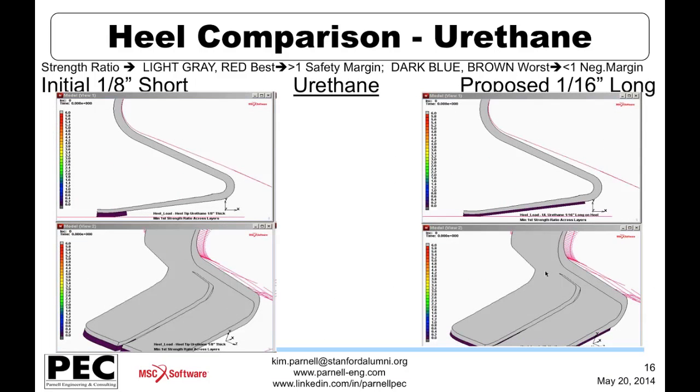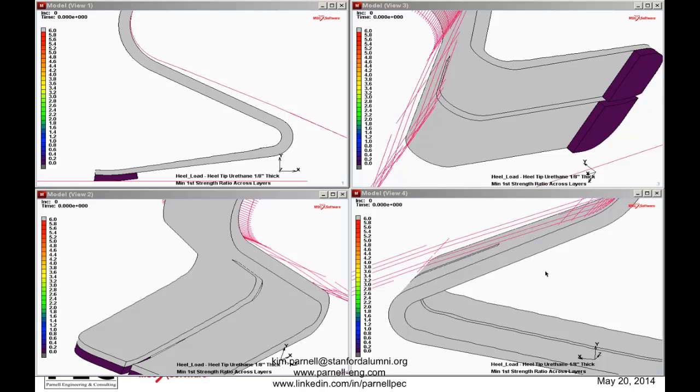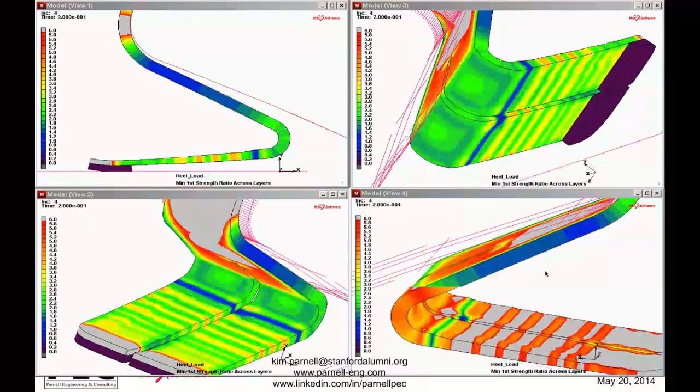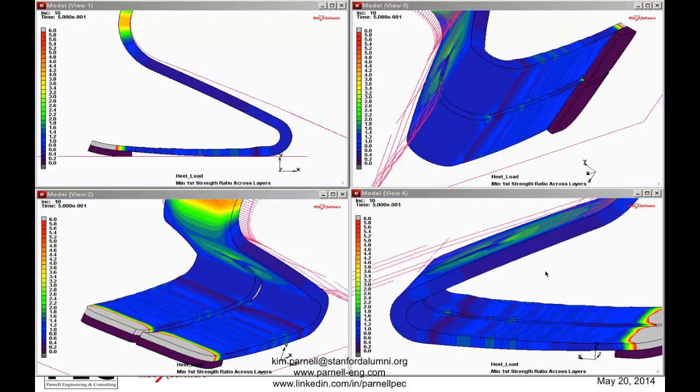And then we're going to step through a few of these pictures just to compare, and this will be for specified vertical displacement, looking at the response as we go through for different views. These are all views now of the short urethane pad as we progressively step through. So progressively increasing the vertical displacement, and how you make contact with the pad, how you make contact with the composite heel component, and then there's another contact here with the surface of the keel.